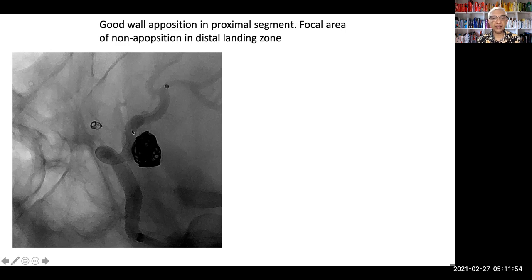Also, the pulling technique is not a very safe technique here because this is very close to the distal end of the flow diverter, and as such we already were compromised. We already were about a millimeter or two below where we exactly wanted. Now, if this patient did not have an acute bleed, we could have started a little more distally in the MCA, covered the AC and come off, and then this could have been a little easier to do.